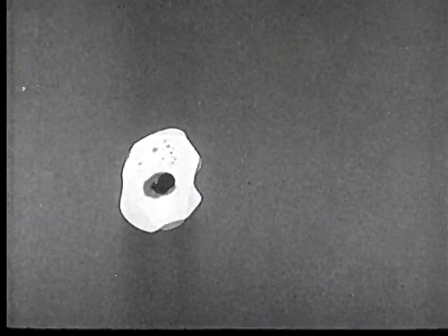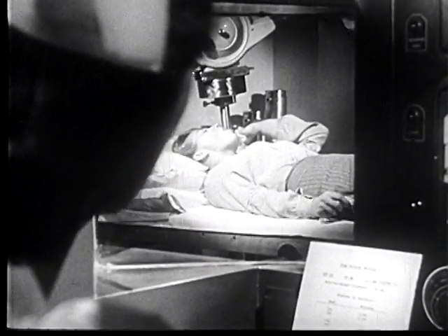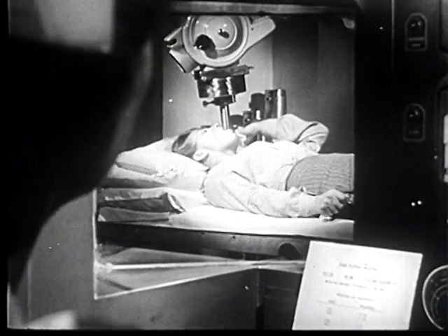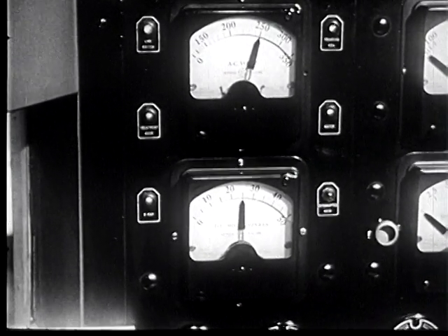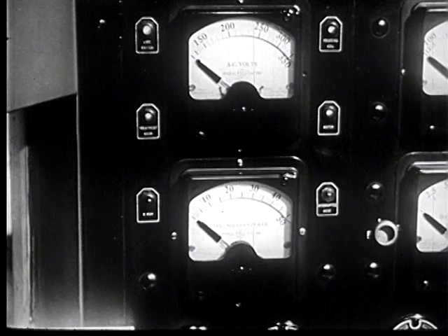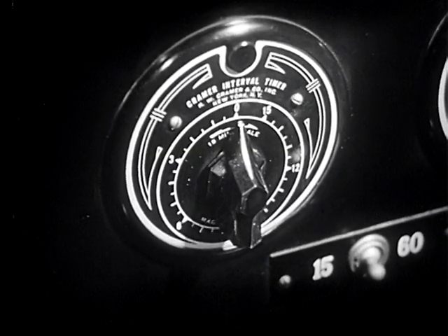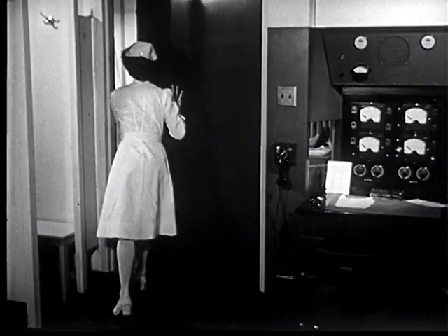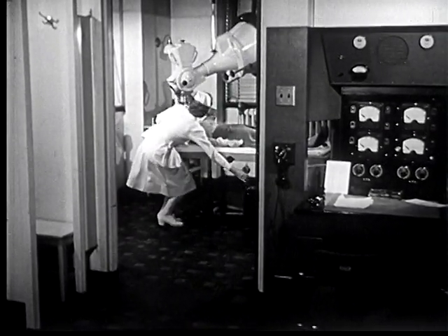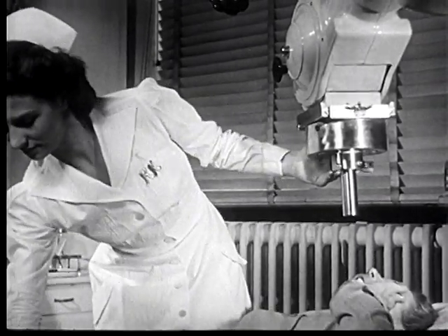As soon as the technician has started the exposure, she observes her patient to make sure she's all right. When the exposure time is up, the machine is automatically turned off by the timer. Mrs. Gordon's first treatment is finished. The technician quickly lowers the treatment table.